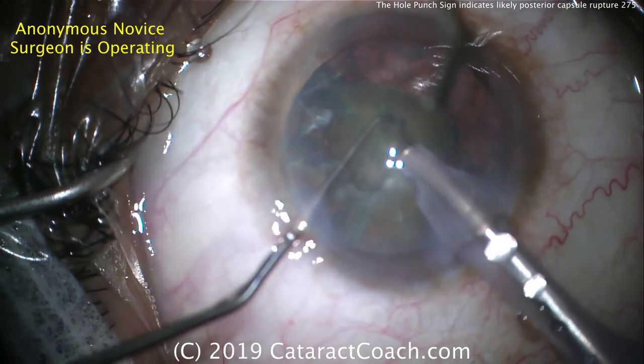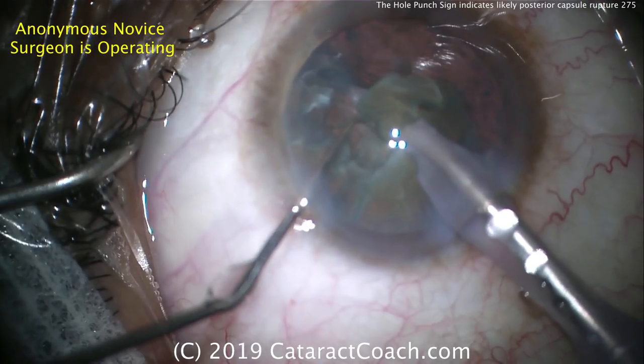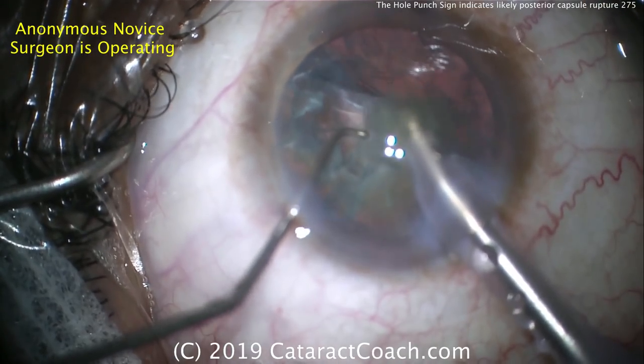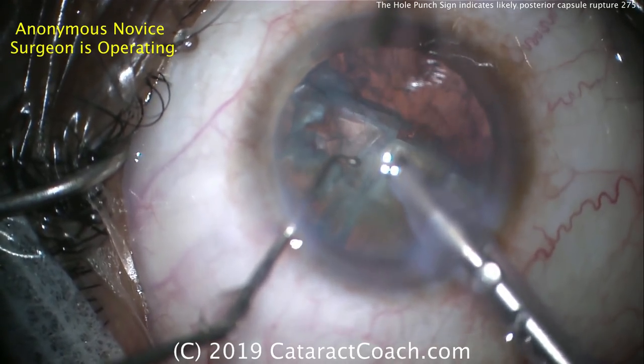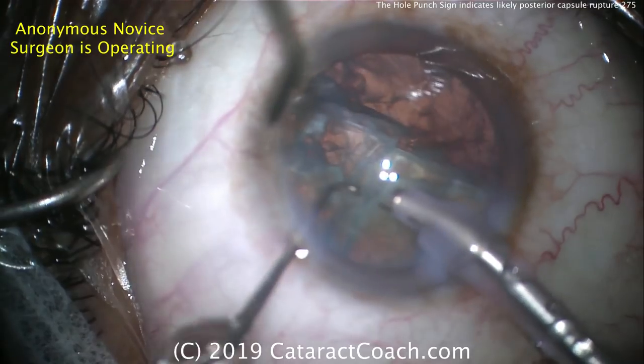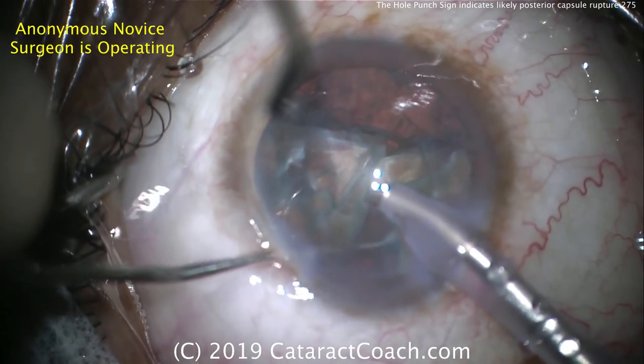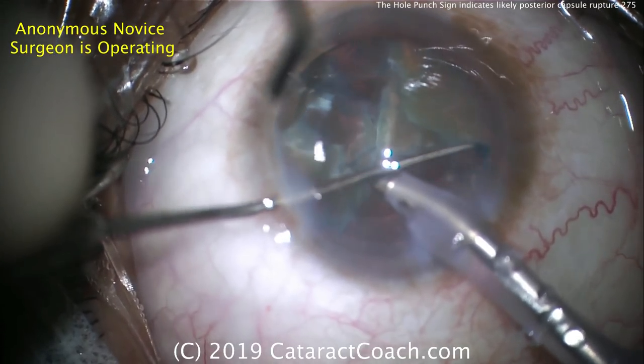At this point, the surgeon still probably doesn't know that the posterior capsule was ruptured. Using high vacuum and going into a relatively soft nucleus and getting so close to the posterior capsule — that's a high-risk maneuver. We learn later in our careers to avoid doing that.